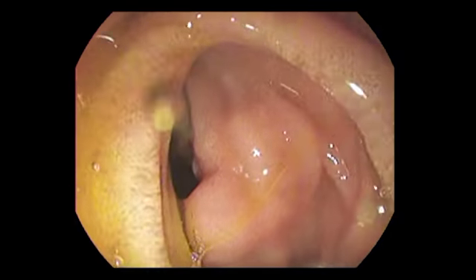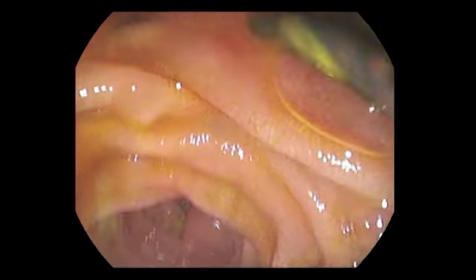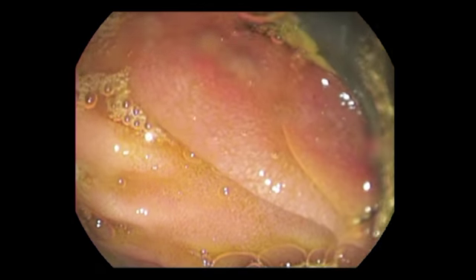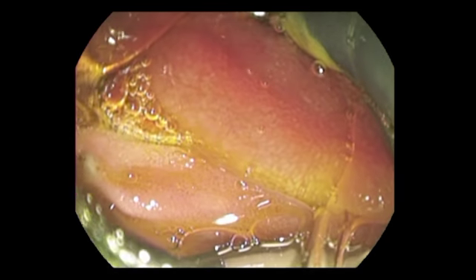Okay, now I will go quickly into the duodenum and try to see the lesion. I aspirate some bile and some liquid into the stomach, and now you see I did the same maneuver, and you see the stent here, and probably the lesion is more invasive than suspected by the first examination. Now I will start the EUS examination.